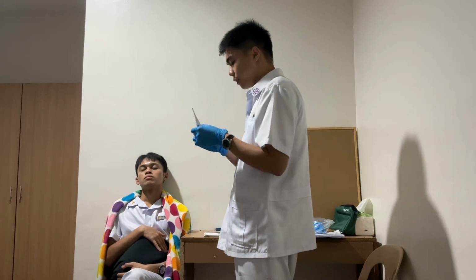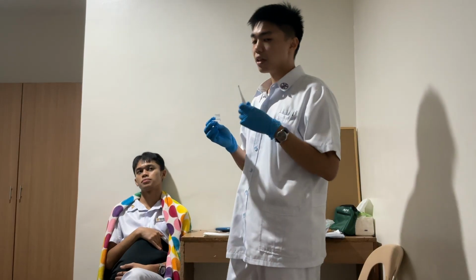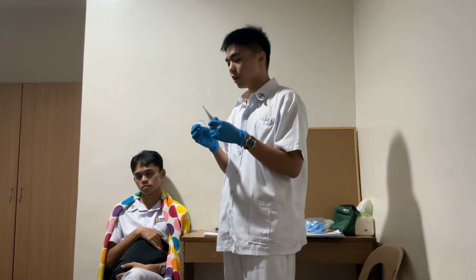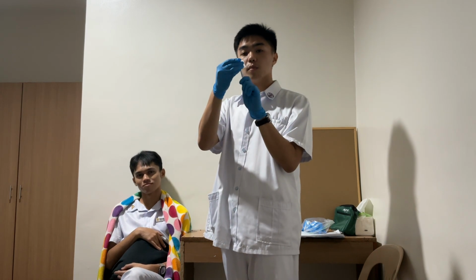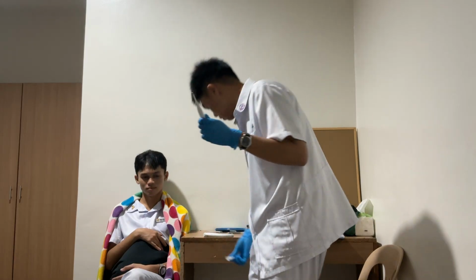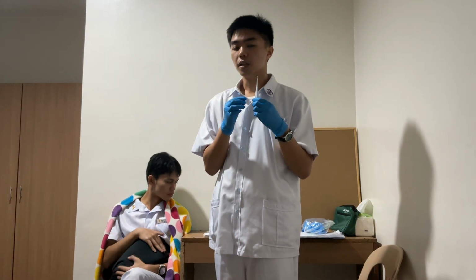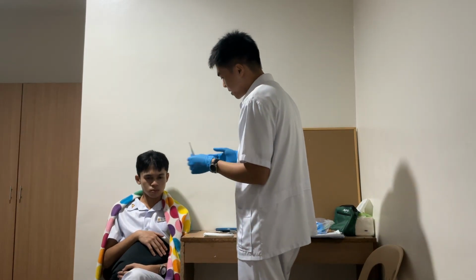In order for us to clean the thermometer, the rationale for this always is from cleanest to dirtiest. Since this is not yet used, we are going to do it from the tip to the body. From the tip, twisting motion, firm twisting motion. Then this part. Once that's done, we can place the thermometer into the patient. Ma'am, I will be inserting the thermometer now.